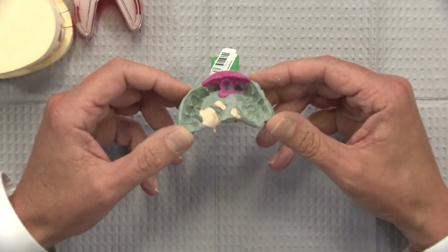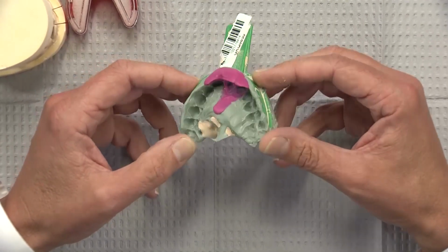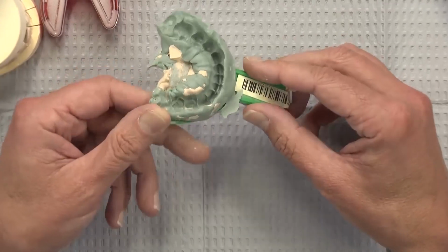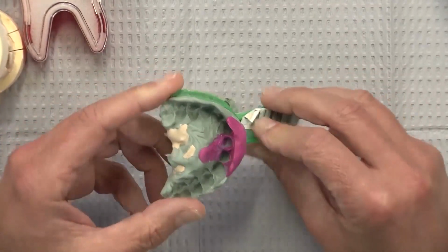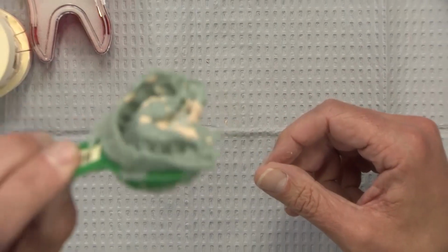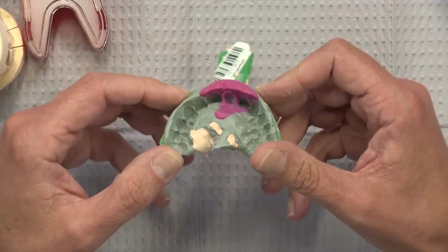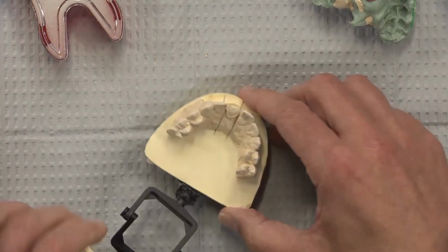We've got an anterior double arch tray, and it looks to be done simultaneously with both viscosities of materials. When I hold it up to the light, I can see that the patient did bite down all the way, and so we've got a pretty darn good impression here. Let's take a look at the model.